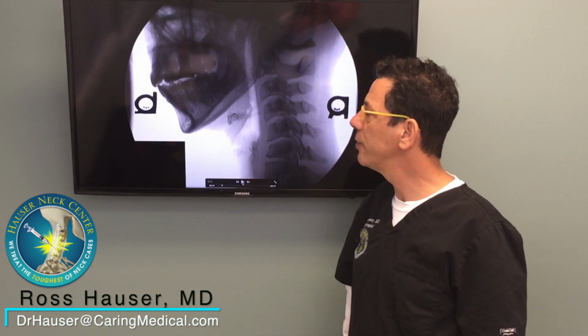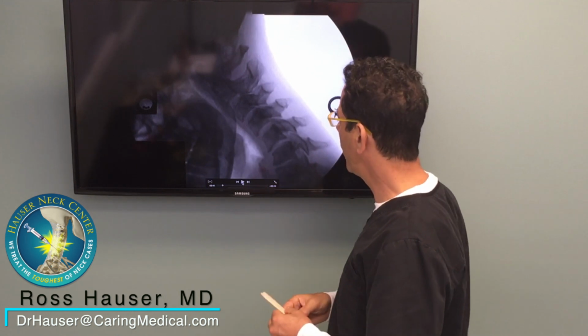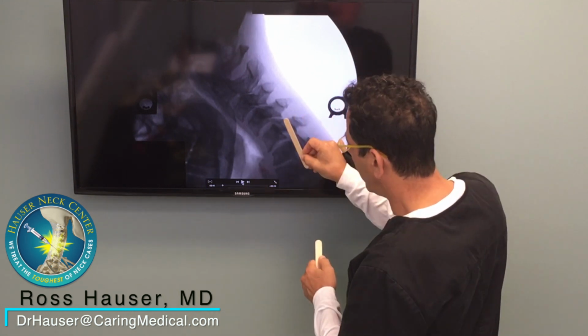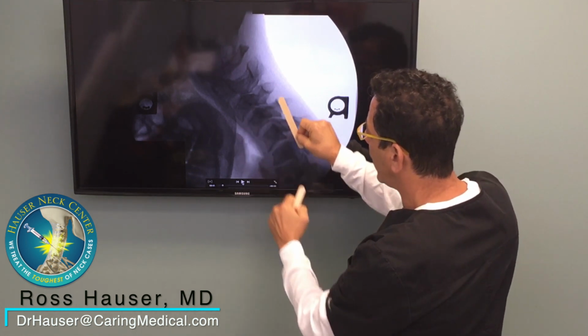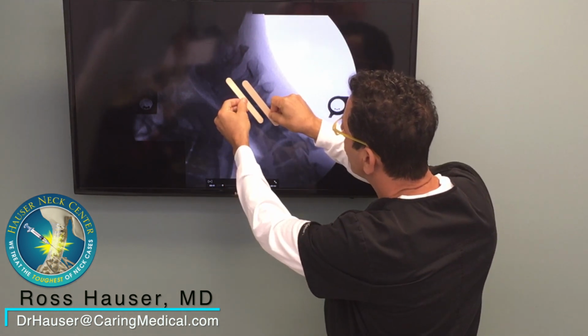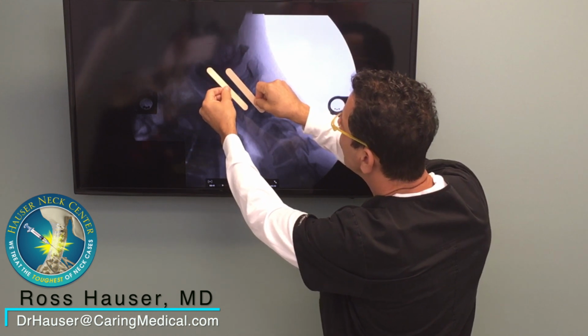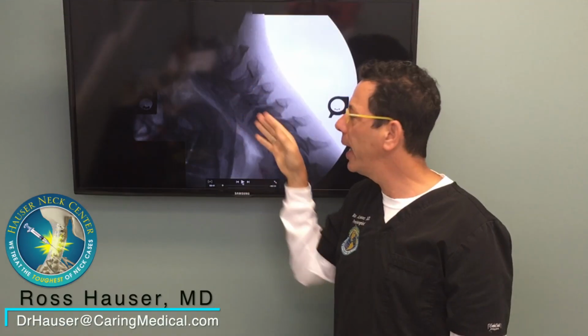And I'm sure once we see her scan, there's going to be all kinds of instability. And if you look here, it's just terrible. So if we go to C6's here, C5's here, so there's all that space here. C4, C5, that's the amount of instability that's there. C3, C4, C2, C3, and the instability is severe. So this person needs extensive amounts of prolotherapy in the neck along with eventual curve correction. But the prognosis for her is excellent.